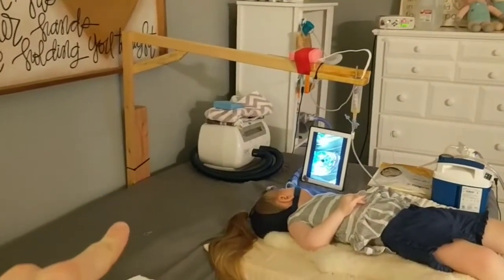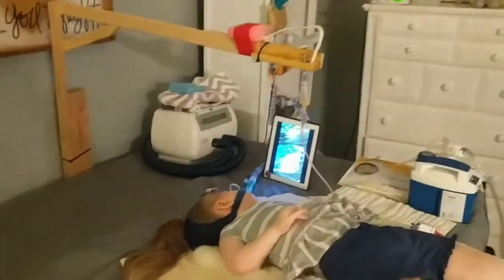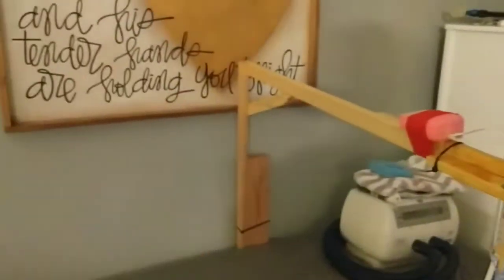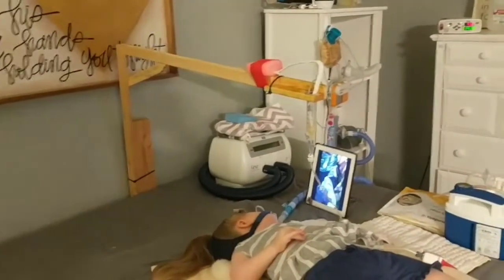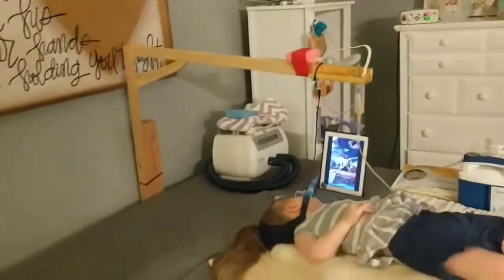The wood has basically another piece on the bottom of the 2x4 that goes underneath the mattress to keep it steady, but it's pretty clunky. There are obviously no adjustment options — it's just stuck where it is, and if I want to move it I have to move the whole mattress. It looks hideous, but it works. It's been really helpful and we've used it for about three and a half years now, but it's just not ideal.